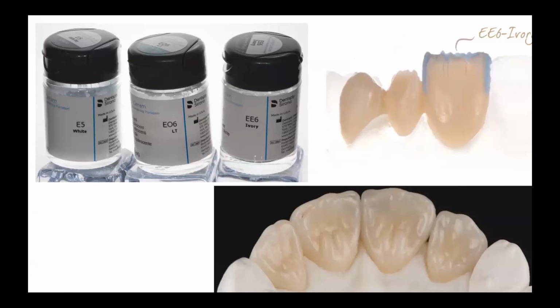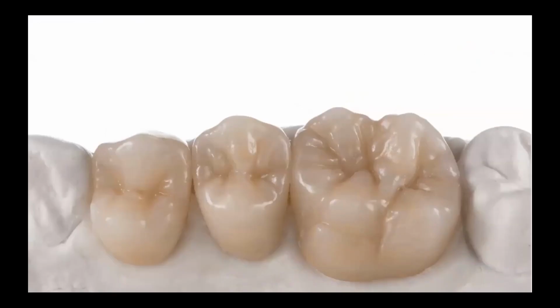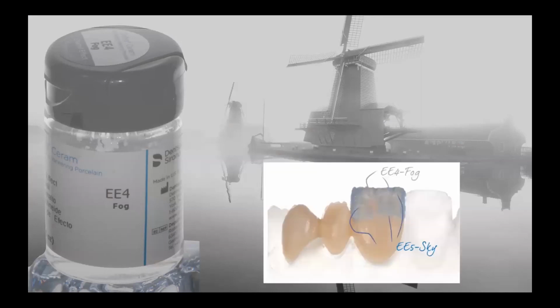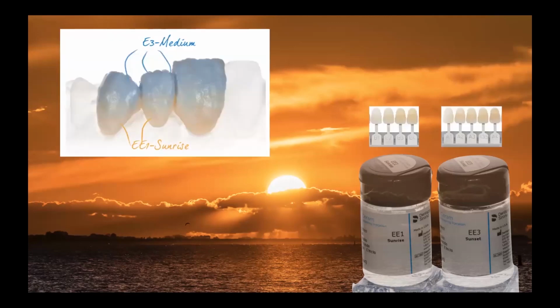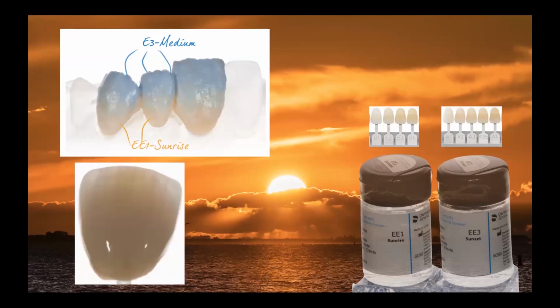Remember to use white, bright components to emphasize cingulums, marginal ridges, or mamelons, for example. And of course, to emphasize cusp tips. This way our restoration will look more natural. We can imitate the gray areas with the help of gray effects, or add them if we don't have enough space for depth of transparency of the enamel edge. And of course, white and yellow and orange enamel effects can be used as cervical enamels to increase chroma of some segments, or to emphasize some colored elements of our enamel.